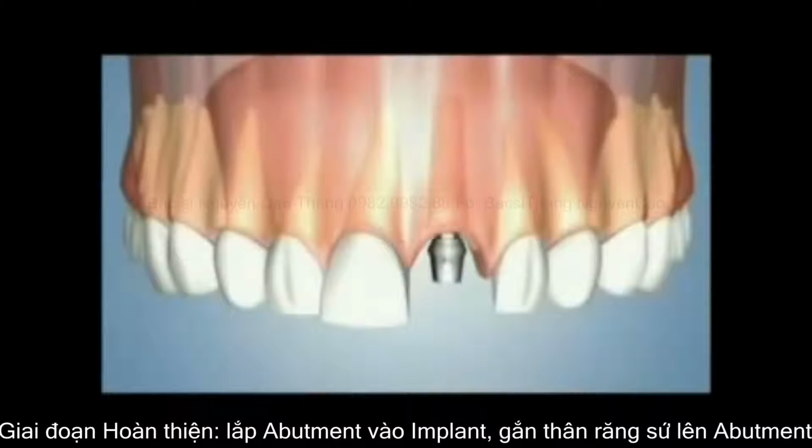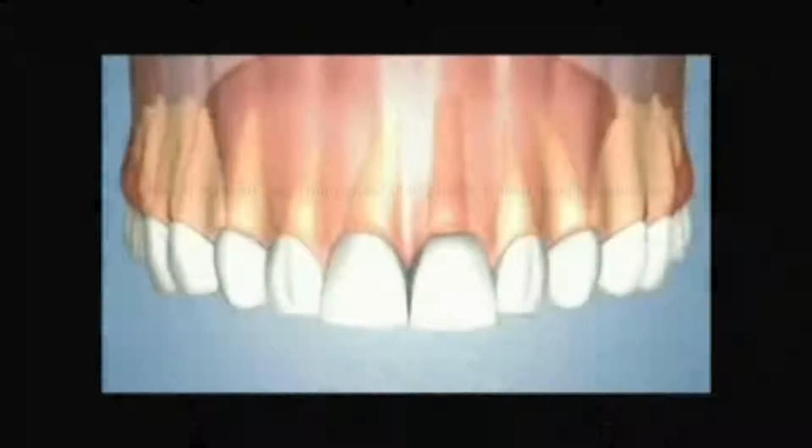The final phase involves the custom restoration being fitted and securely placed.